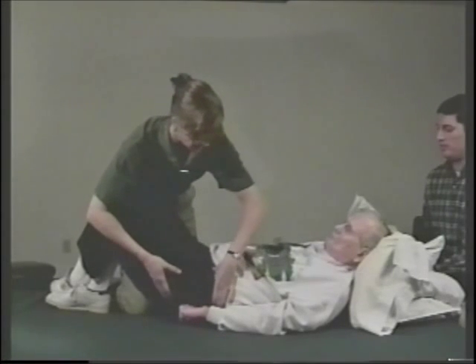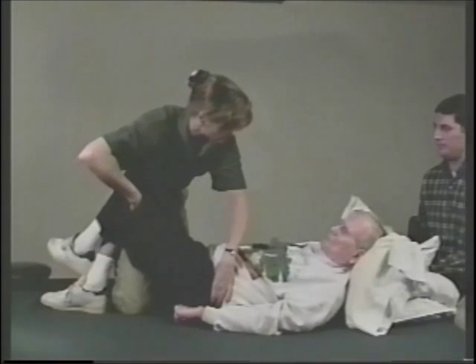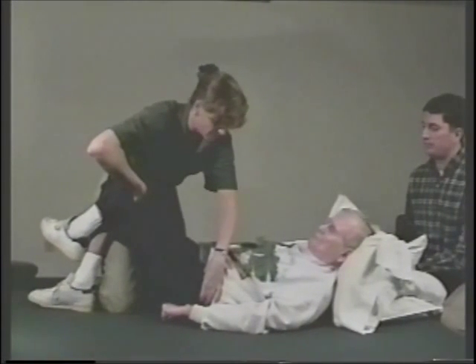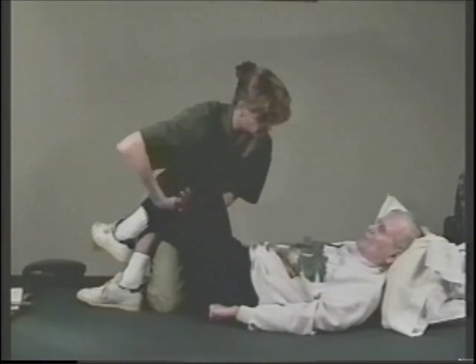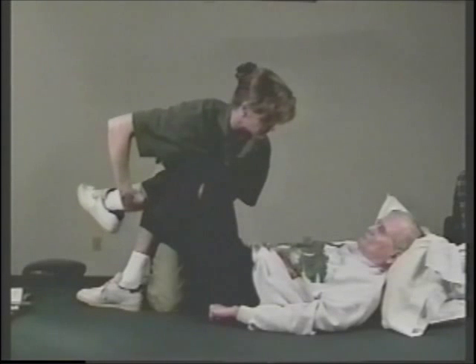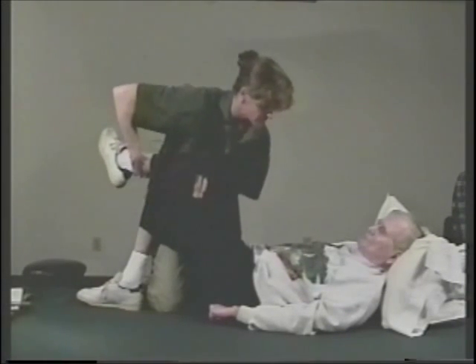Looking at the pelvis with hands on the ASIS, the posterior aspect of the pelvis, bringing the leg up. You feel the pelvis engage right here. Going from behind the knee, bringing the leg up, testing hamstrings. His hamstrings are tight at this point.